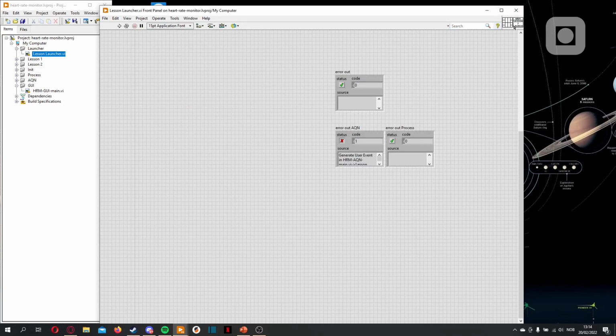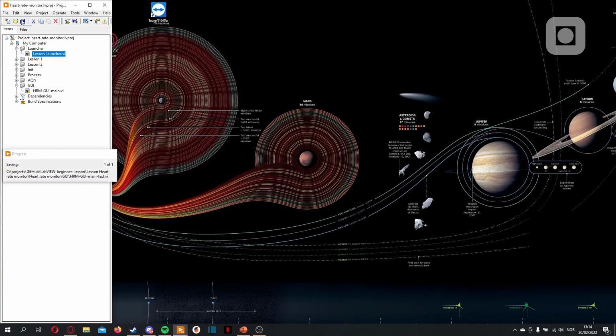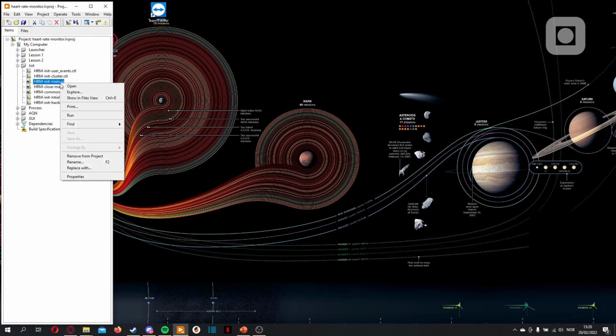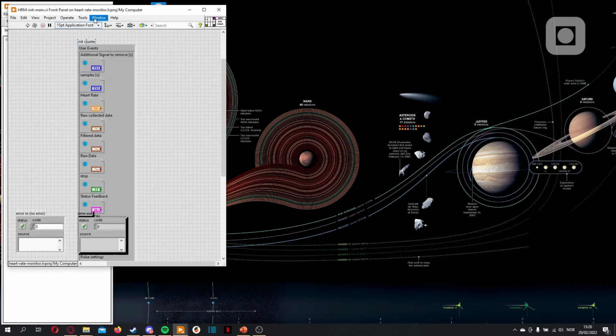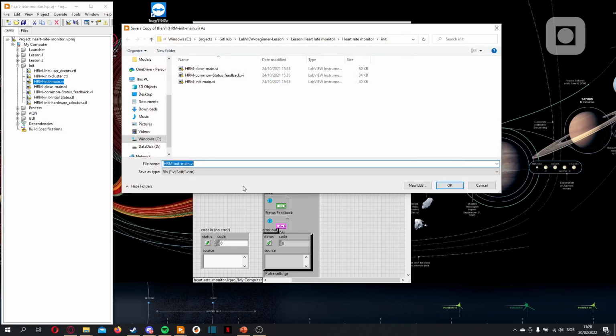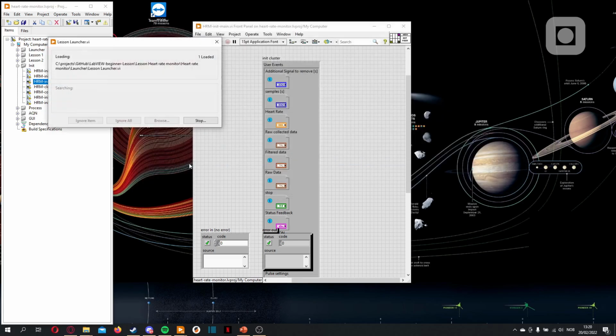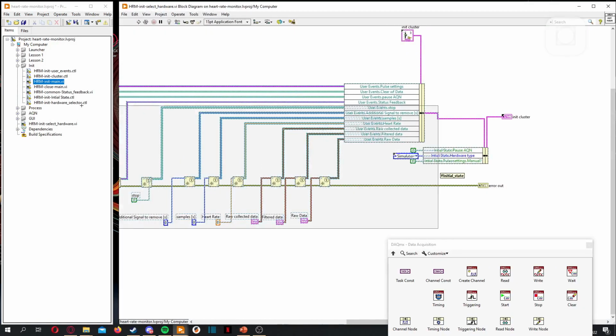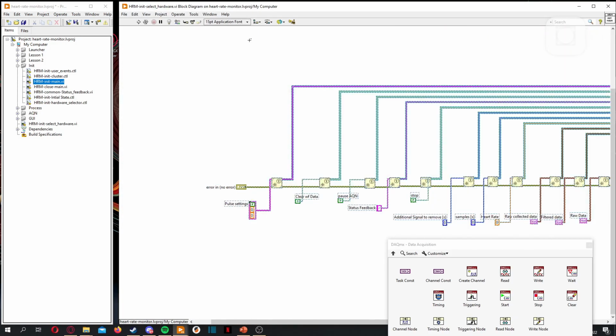Let's now move to the selecting of hardware. Selecting which hardware you have at launch. The next step would be to add the hardware selector. So this is part of the init, so let's just copy this one because it's got all the stuff. So open additional copy, and we'll put it in init, and then we have init select hardware. Now we can delete all the contents here because we're not going to do that again.